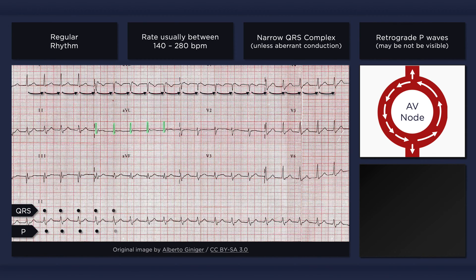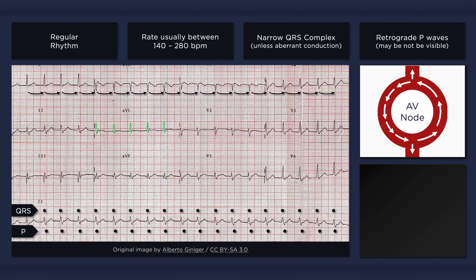Now if you look closely, you will notice that there aren't any P waves before the QRS complexes. Instead, there is a terminal deflection right after the QRS complex. Don't let this confuse you into thinking that the QRS complex is wide, because although the terminal wave abuts the end of the QRS complex, it is actually due to the P wave. This terminal deflection is actually just the P wave showing up a little late and distorting the end of the QRS complex. Retrograde conduction of a P wave is referred to as an atrial echo beat.